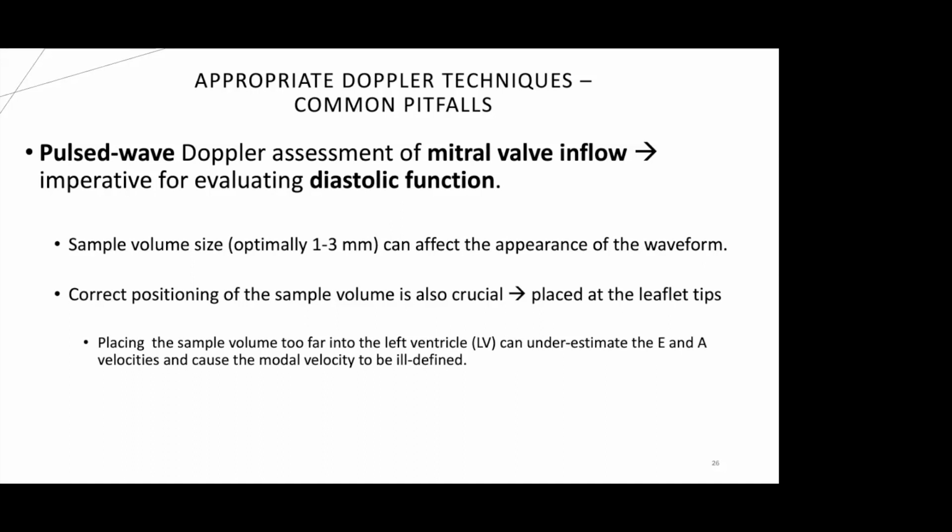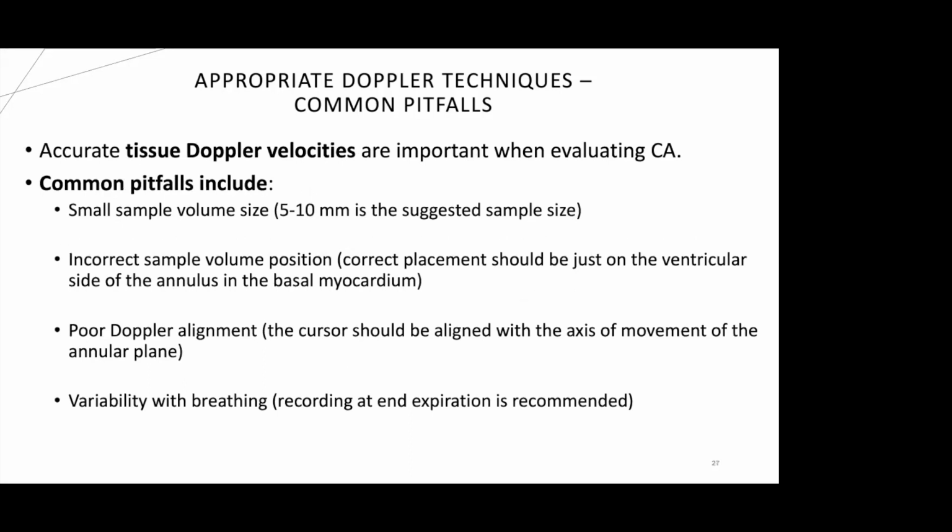And then the same thing again with tissue Doppler. One thing I often find frequently done here is that it's actually slightly rotated when we're in a 5-chamber view. We often get a little bit of outflow tract involved there, which gives you these funny measurements. They're often less, and we know that the lateral annulus should be higher than the septal, but it's less because we're actually not truly measuring the annular displacement there.